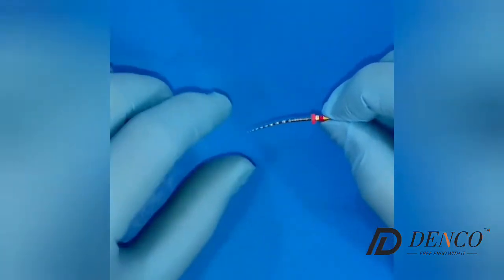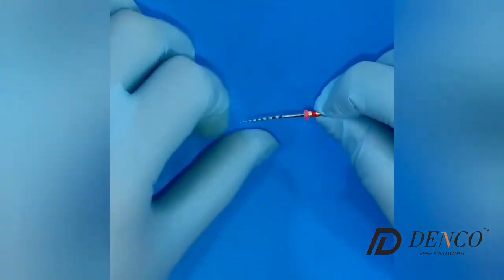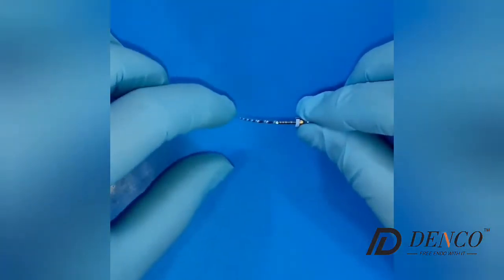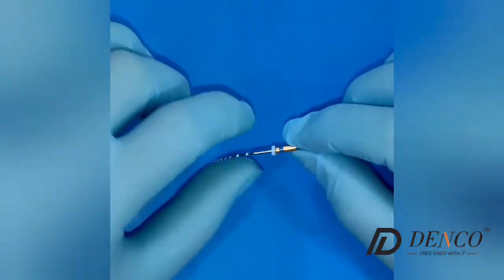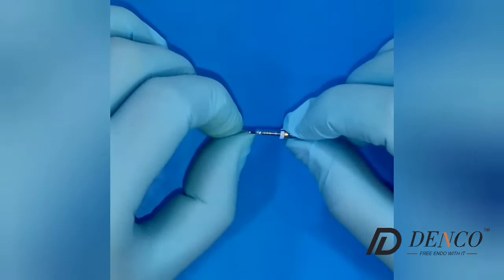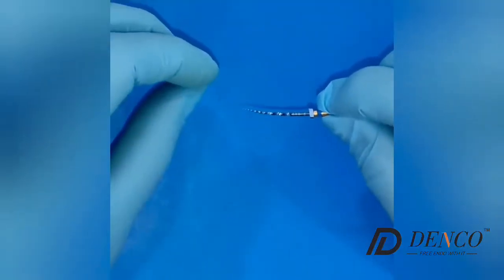This is the F2 for bigger canals — canals with more diameter. And the F3, as you can see, is also very flexible even when it has more mass in the whole file. You can see how flexible the F3 is. You can also find these files in F4 and F5 if you want to treat a bigger canal.